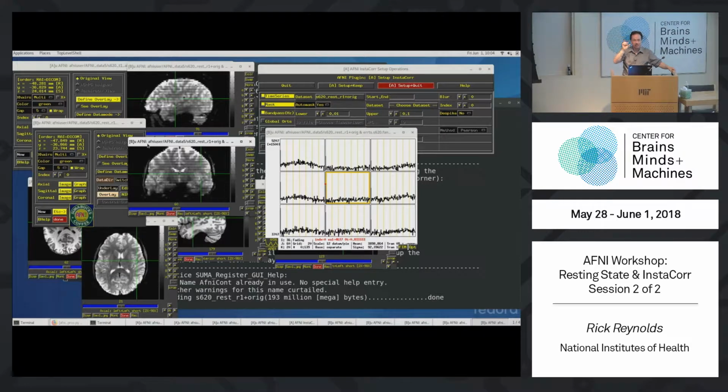It's not perfectly within each slice, right? This bleeds across neighboring slices to some degree. That's why we used alternate interleaved slice acquisition, because of that bleeding. So the even slices get hit by this first, and then you go back and get the odd slices. The odd slices have already been magnetized a bit. They've already gotten some of this, this field map has already hit them to some degree. So you actually see a difference between the even and the odd slices here.